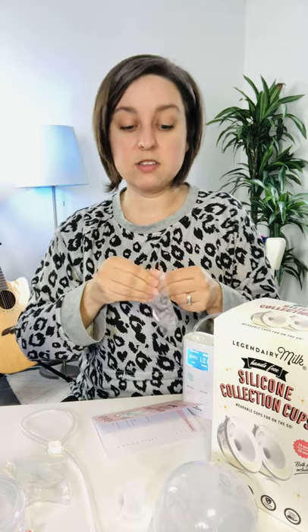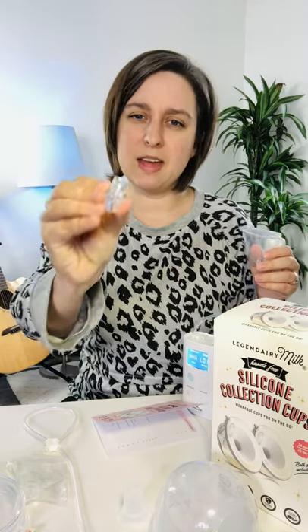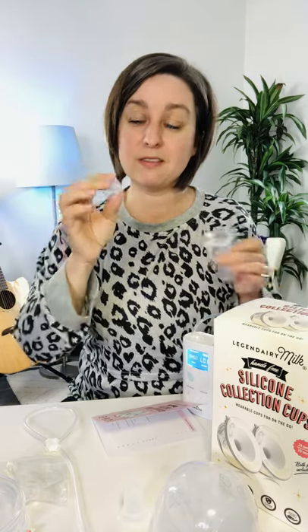It also comes with two extra parts and comes already assembled. You do need to boil the parts — not the tubing — before first use to get it extra clean. It comes with some extra duckbill valves. These are different sizes than the traditional duckbill valves you'd put on a Spectra pump, so you have to get the smaller ones made for these cups.